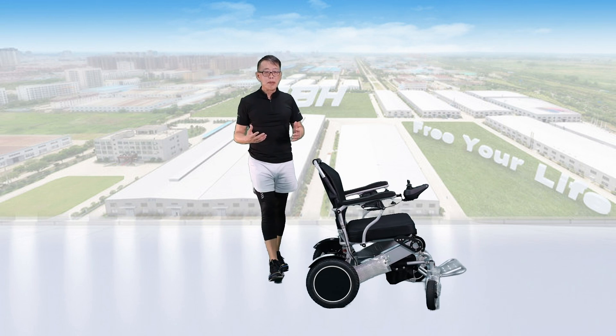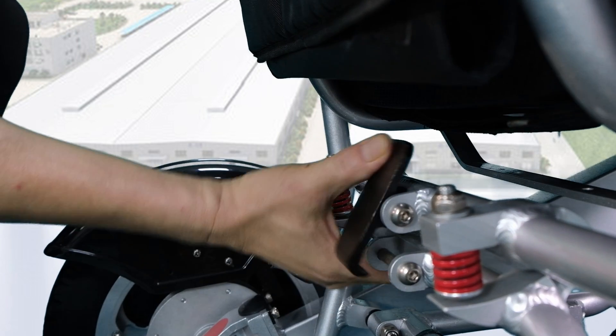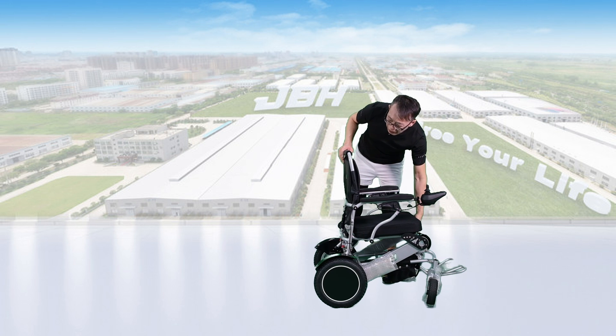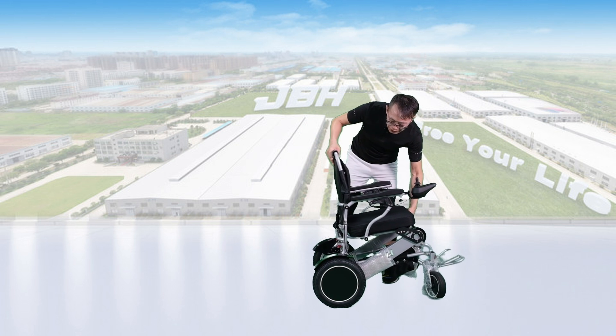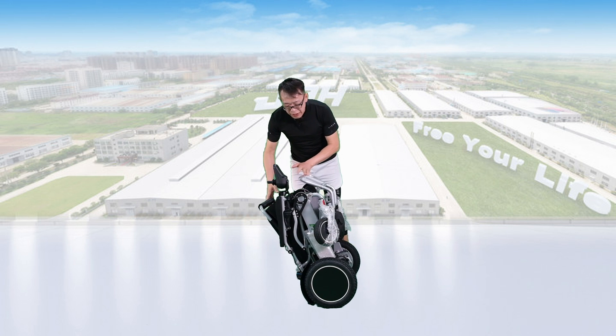To fold the wheelchair, we just need to press the button here with one hand, and push the seat back to the front a little bit. One hand holds the frame, the other hand holds the top of the seat back, and push them towards the center. Then you can close it in just one second.